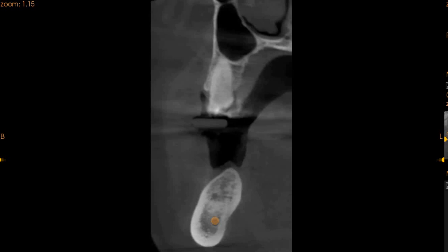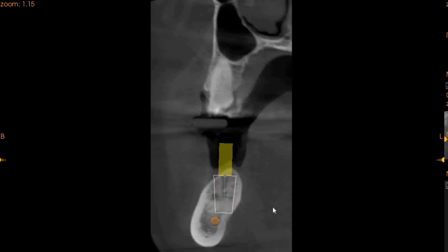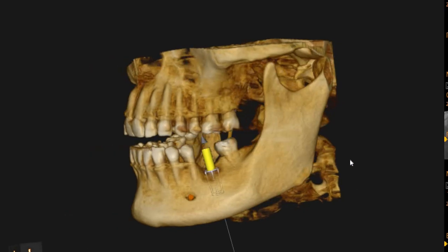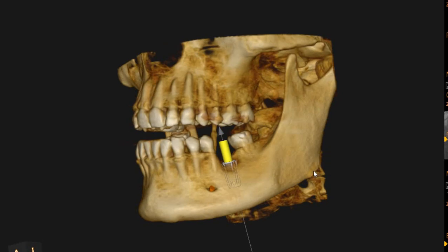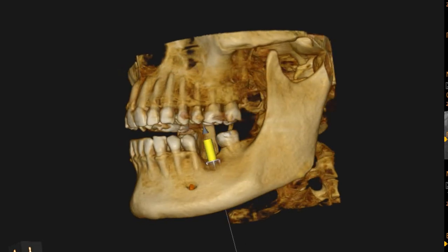In this region we've placed an Iris implant. This is the most ideal location for the implant, which will have complete bone support. We've shared an implant planning report for you. The yellow part constitutes the prosthetic portion, which is why this will be a prosthetically driven implant placement. You will have sufficient bone support and sufficient height for a prosthesis.